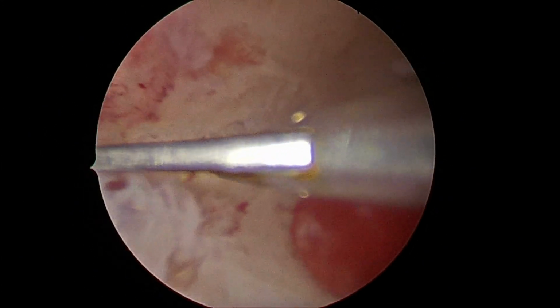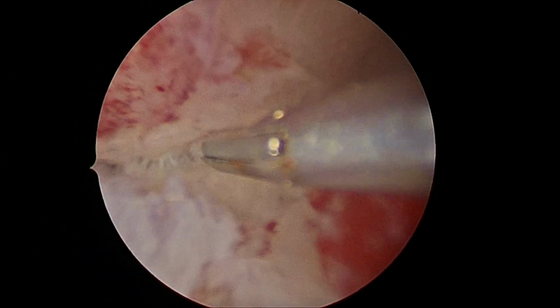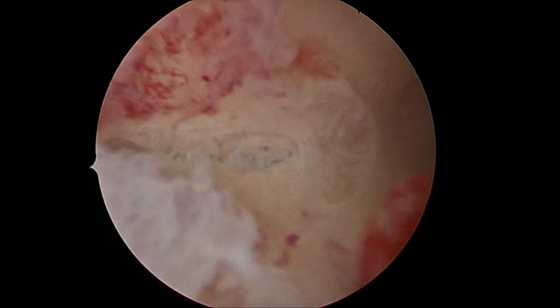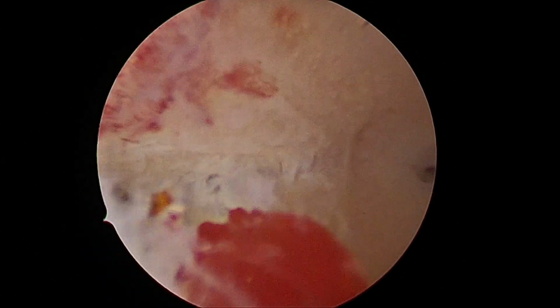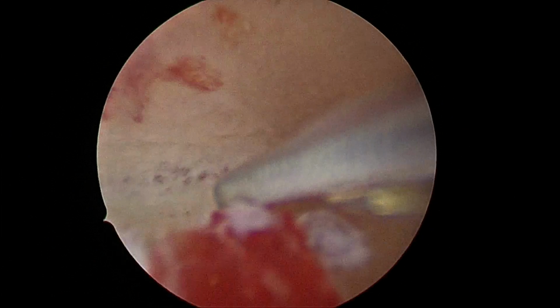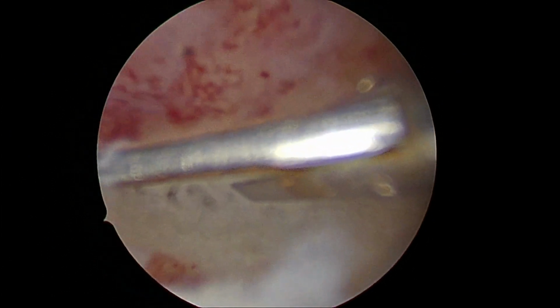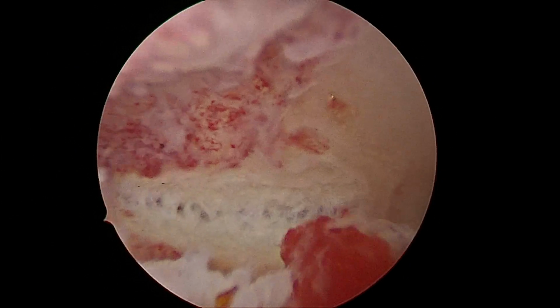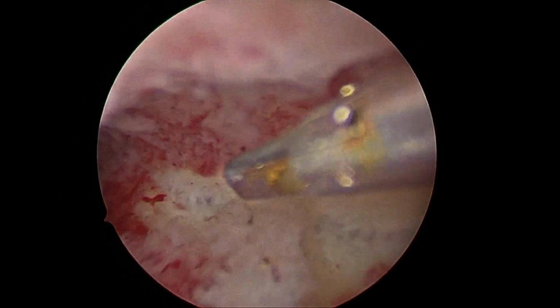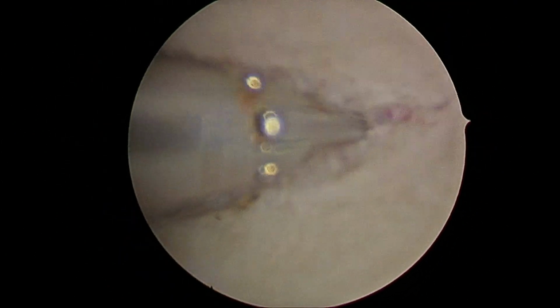Few snips near the fundus of the uterus were sufficient to make it normal, and in a panoramic view we can see both the tubal ostia, which may be helpful in improving the IVF ET results.